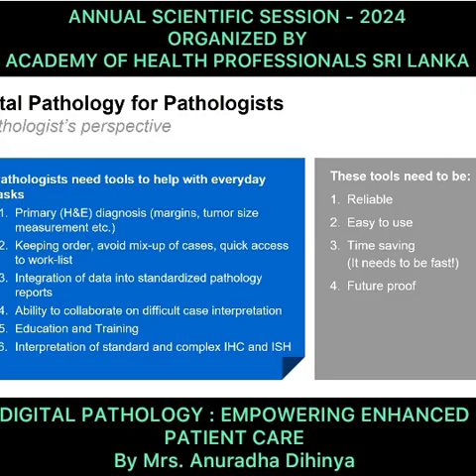Now, medical colleges are using a digital display monitor kept in the lab, where the mass population is looking at those cases and the examination is conducted. It is also used in the training part. The difficult, challenging cases can be shared with the students, and pathologists can share all those cases where you are required to train them virtually. So that is also possible.